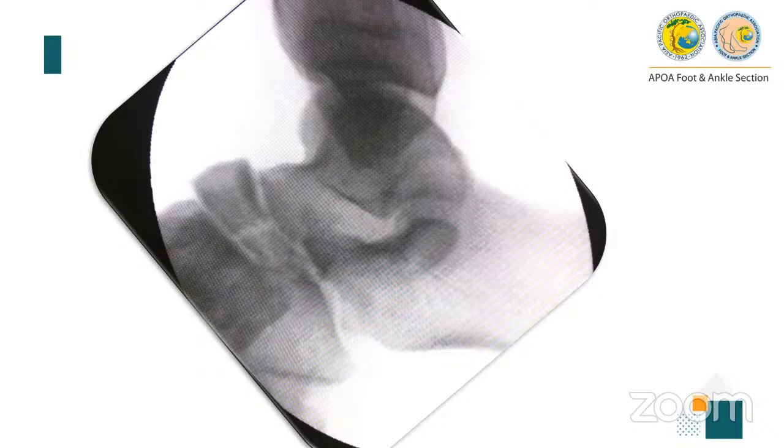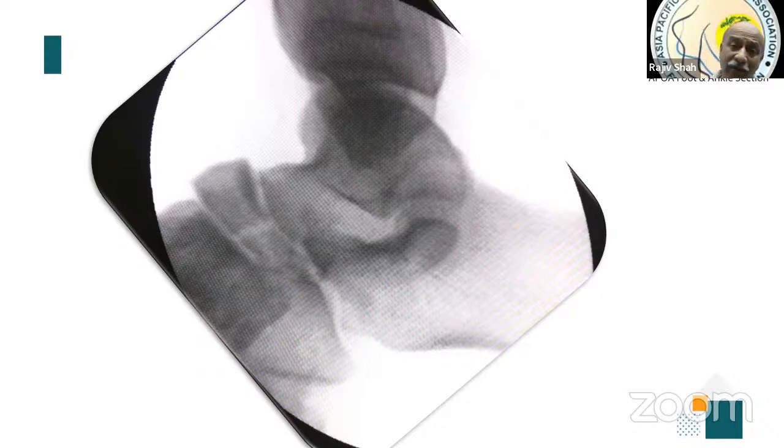But you know, when you see the navicular open reduction video, you would learn that you should be smart enough to slide your clamps before you put in your Hintermann distractor. If you do not slide your clamps over your K wires, then you cannot really put them in afterwards, because then you have to remove the Hintermann distractor. How are you going to maintain the distance? So that is the trick I am going to show you.